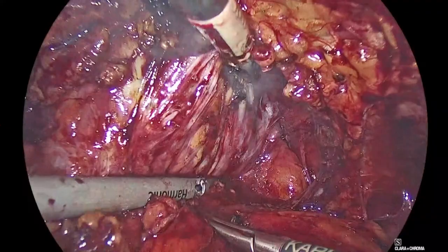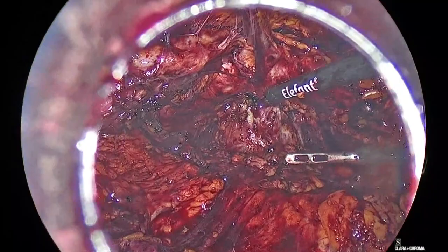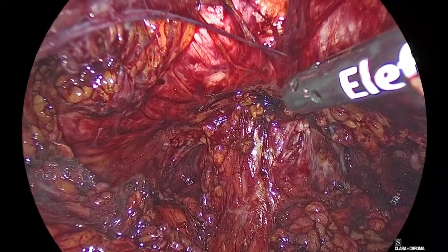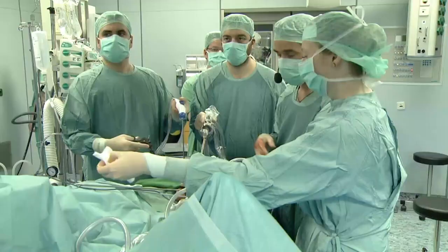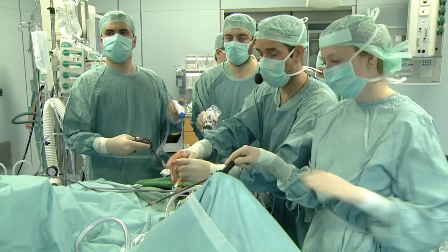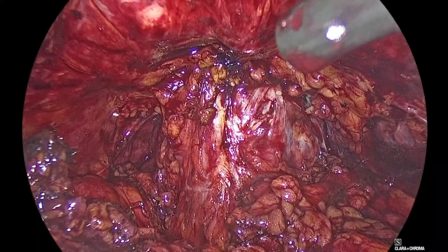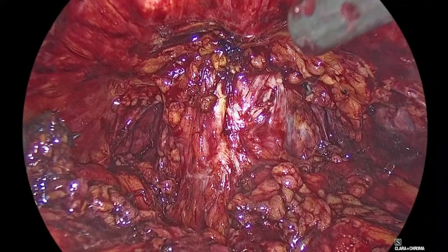Good. Okay. So let's go for the bladder neck now. Yes. I'm Franco Gabbardi. I have a question for you. Do you spare the endopelvic fascia? Some prefer to leave the endopelvic fascia intact and go directly to the bladder neck. What do you do? Always this way, open, or sometimes you spare the endopelvic fascia? No, I don't spare the endopelvic fascia. I don't cut it. But I dissect it, as you saw. I want to see the lateral borders of my prostate.